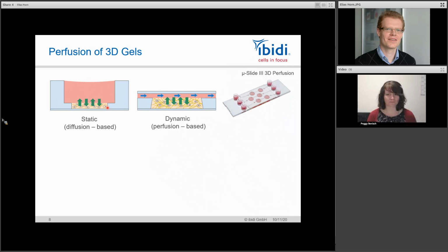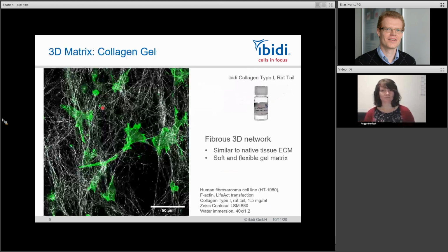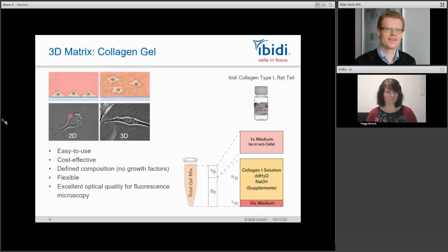Yeah, that is an interesting thing, because if those cells embedded inside the 3D gel like to attach to the bottom more, or to the flat surface more than to the gel, then you will quickly see exactly this. You will see this and gel on top, and have some kind of a 2.5D situation.